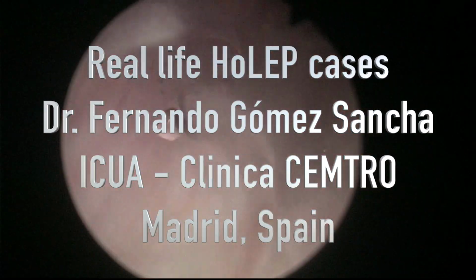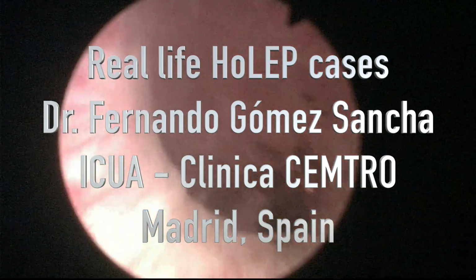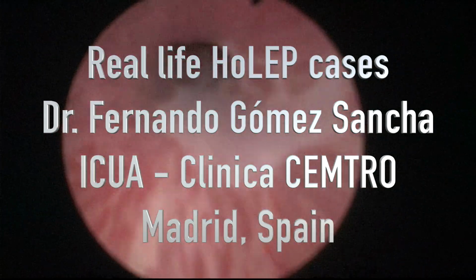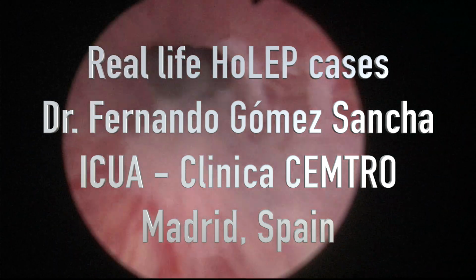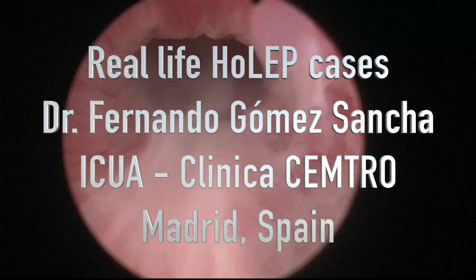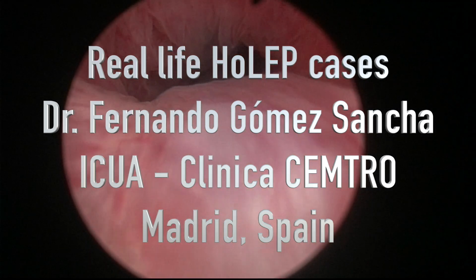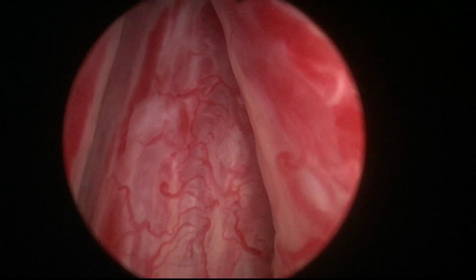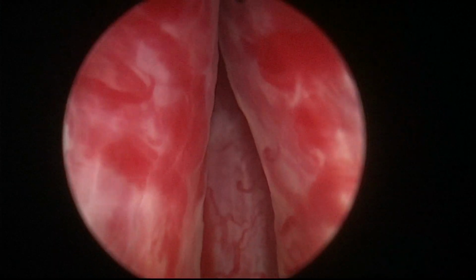Okay, so we're going to start with this man. This is an obese patient with a strange looking urethra, with a very large gland. He had a relatively high PSA. We did an MRI, and we found a suspicious PI-RADS 4 lesion.